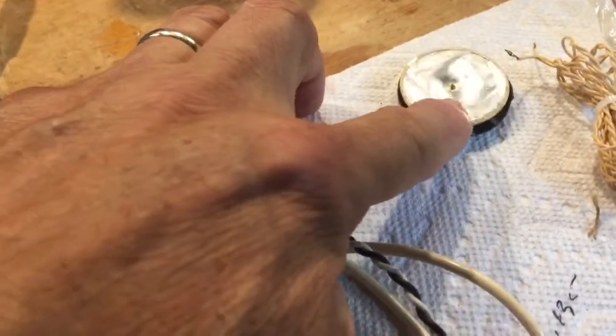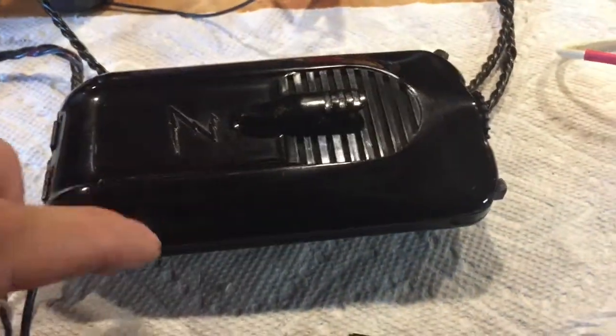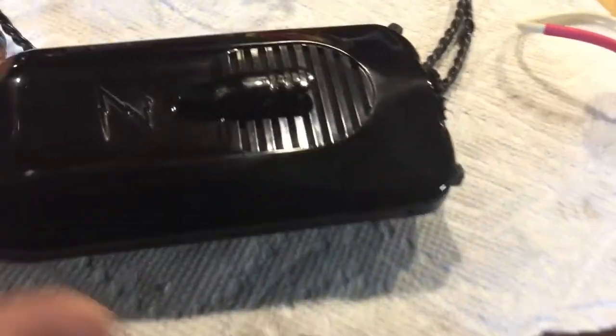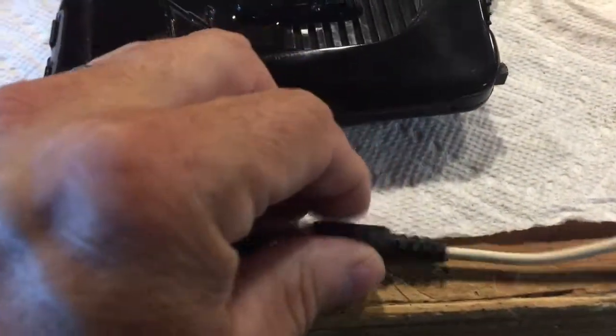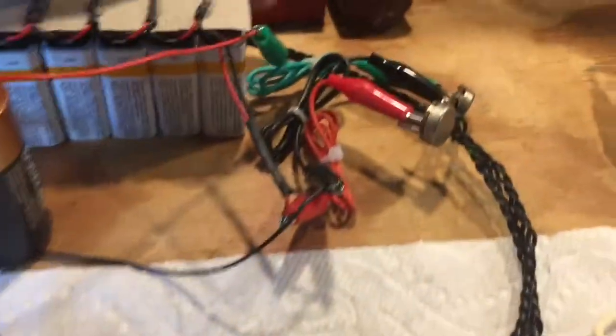I could have purchased a replacement element on eBay new for $40, but I'm obviously not going to spend $40 on a microphone element for a $30 hearing aid that I'll never use again — it'll just sit on a shelf as a talking piece. So I modified it without damaging any of the original electronics, just added an external microphone.